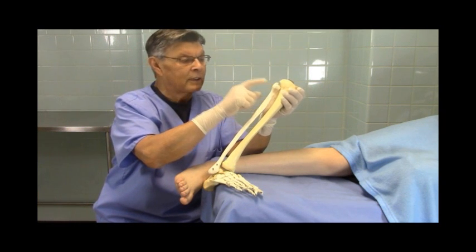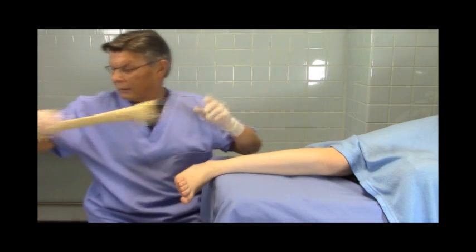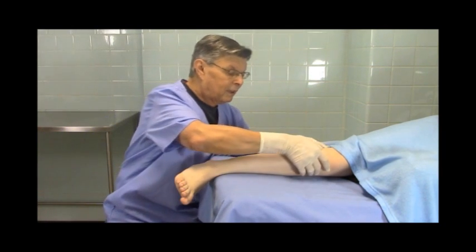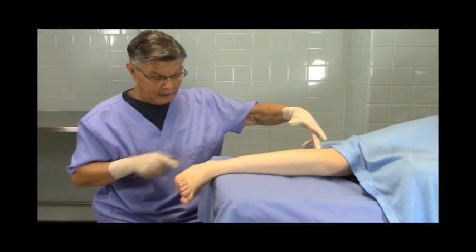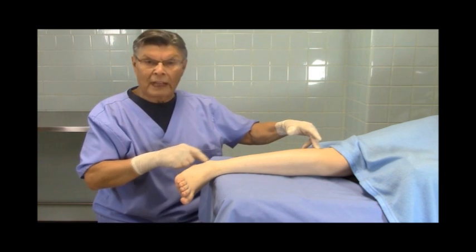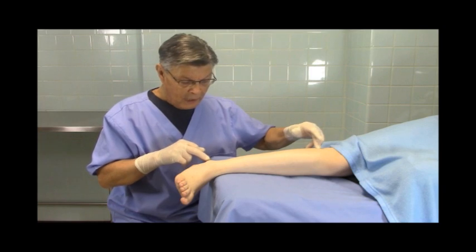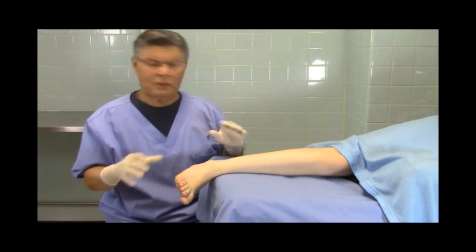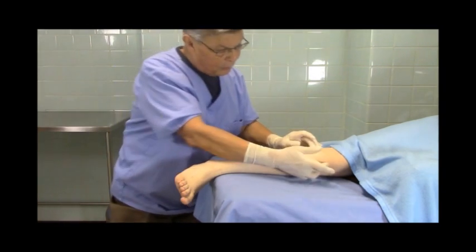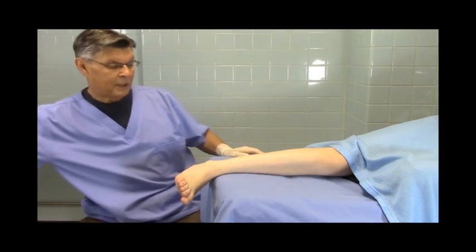In most people, you'll be able to find the tuberosity or the head of the fibula. When we have a patient like Lily here, who is a young lady with beautiful structures, it's easy to find where the fibula is. It's also easy to find the lateral malleolus. Sometimes, as is the case with most patients who are heavier or older, if you have a hard time finding the head of the fibula, all you have to do is look for the tuberosity of the tibia and then go across — that's where you'll find it.